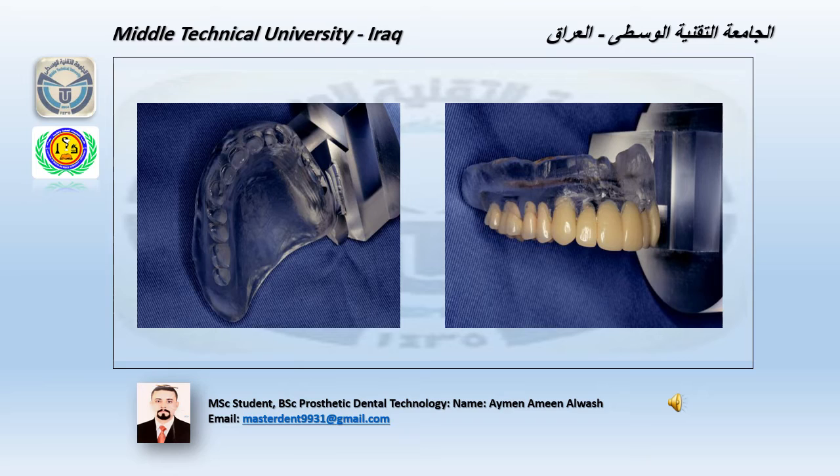Now we are ready for milling by using a cutter path based on the 3D denture based image, a 5-axis CNC machine cuts an acrylic resin block. We use a clear acrylic resin block for milling the complete denture. It takes about 150 minutes, and after complete milling, the artificial teeth are bonded to the denture base using resin cement.